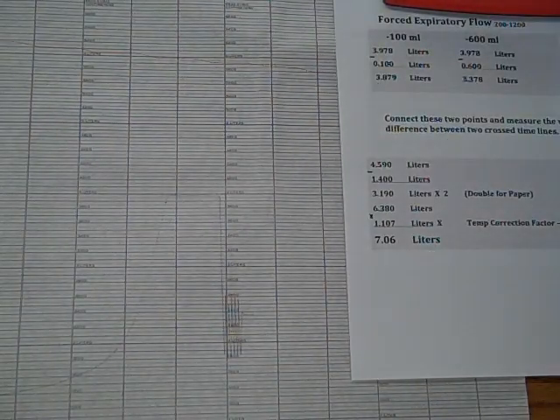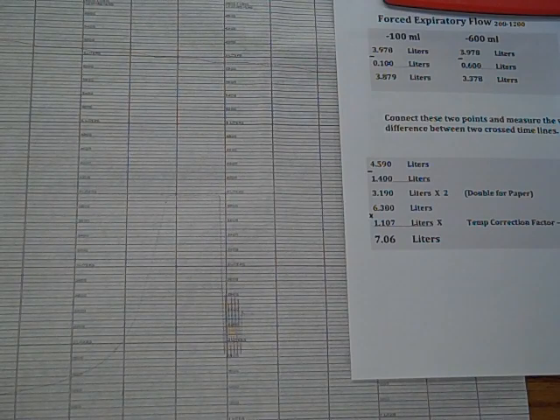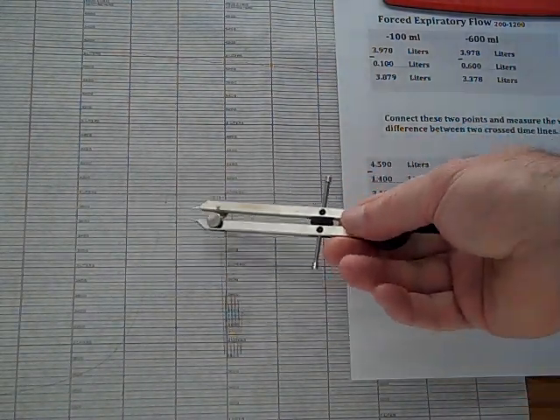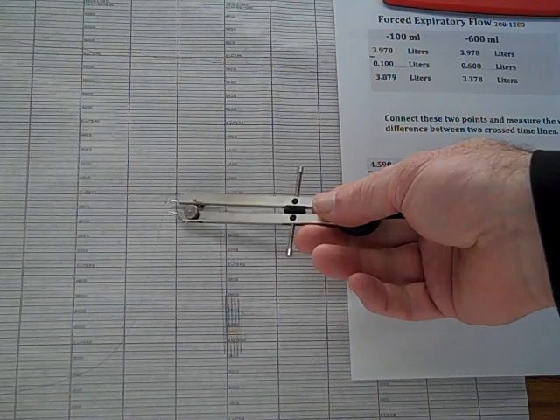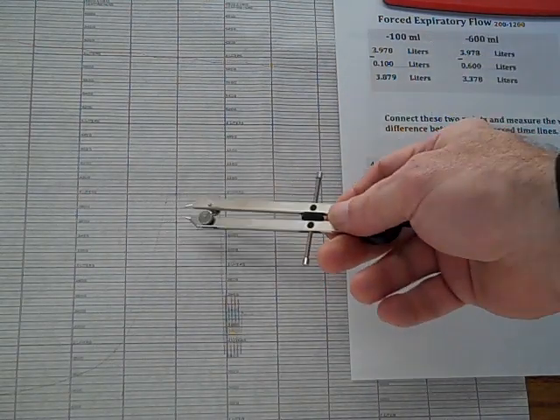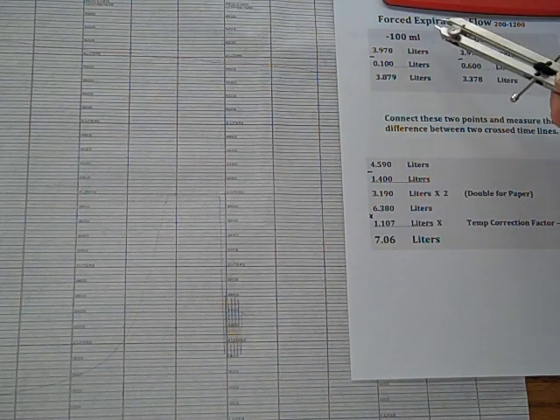Another one we might do, and we used to do this for peak flow measurements, since a computer can get that one instant. Here we had to go where the slope of the line was the fastest and the exhaling is the quickest. And we put a little line at 200 milliliters down, and we put another line at 1,200 milliliters down. Now, because we have to double for the paper, that 200, 1,200 is actually 100, 600.